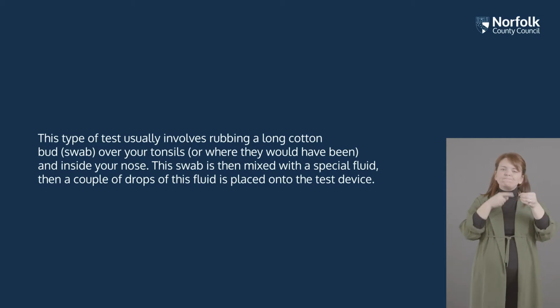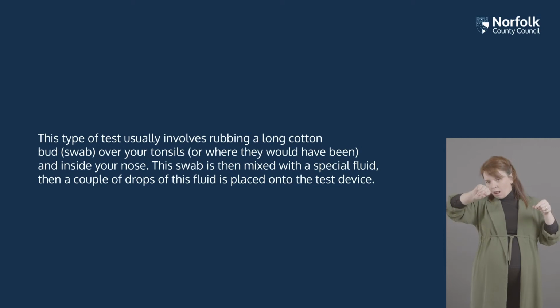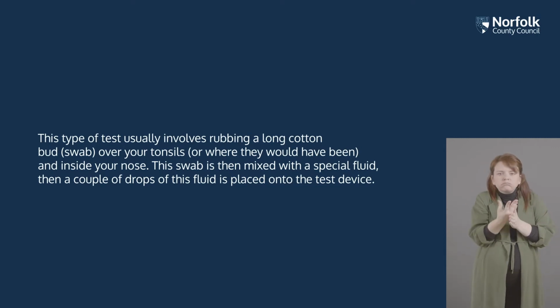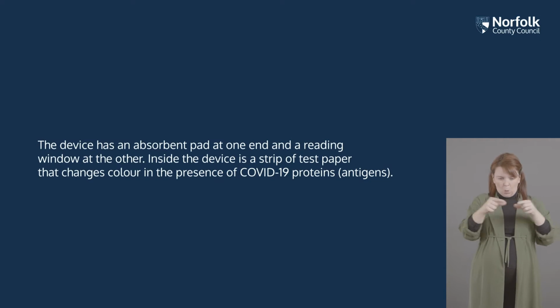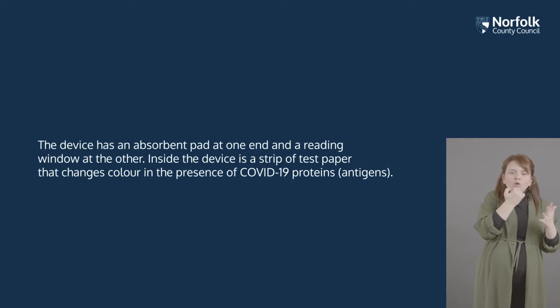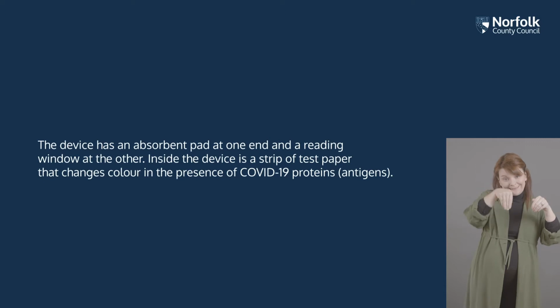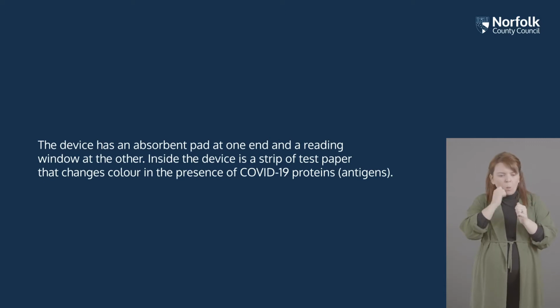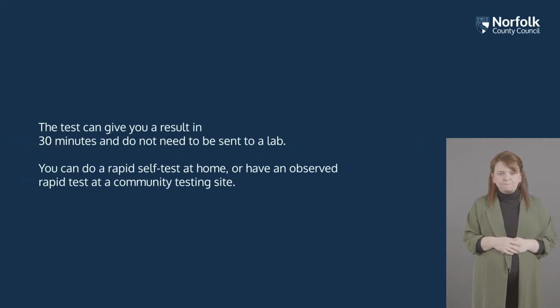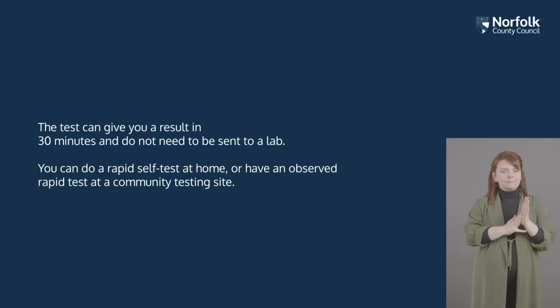This swab is then mixed with a special fluid, then a couple of drops of this fluid is placed onto the test device. The device has an absorbent pad at one end and a reading window at the other. Inside the device is a strip of test paper that changes colour in the presence of COVID-19 proteins, antigens. The test can give you a result in 30 minutes and does not need to be sent to a lab.